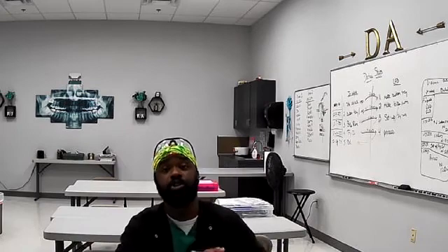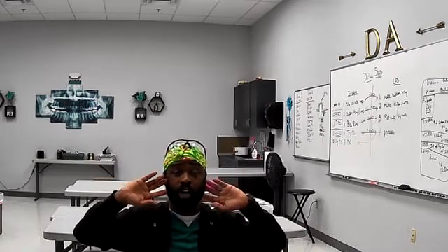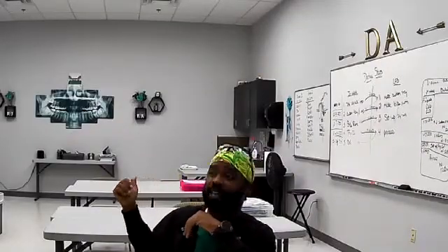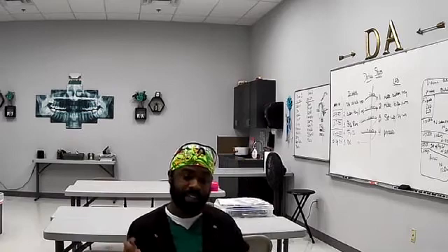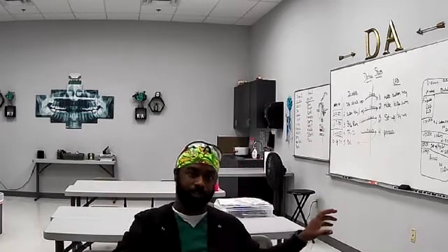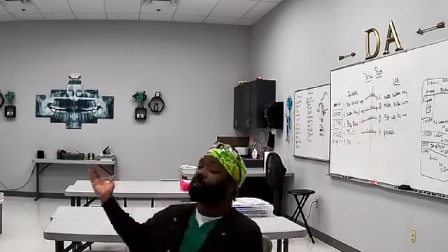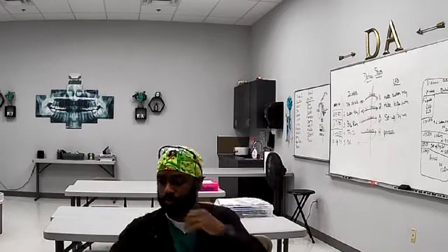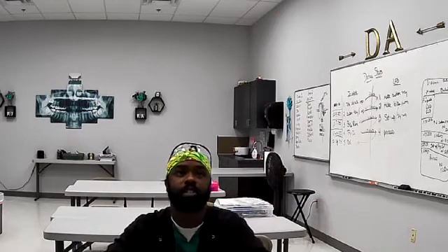Panos are great. A pano shows everything in one big picture. The picture behind you, yes, that's your pano. Exactly, that's your pano picture. And the FMX would be just picture, picture, picture, picture, picture, picture. But it would make up the entire dentition, just not one full shot of every single tooth. You still get every tooth, just with more detail.